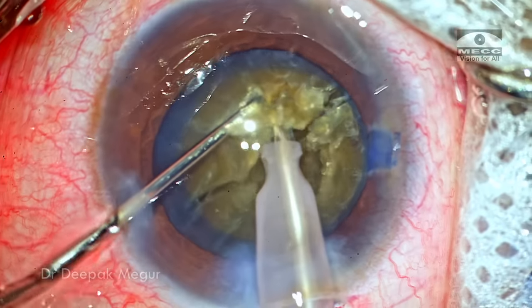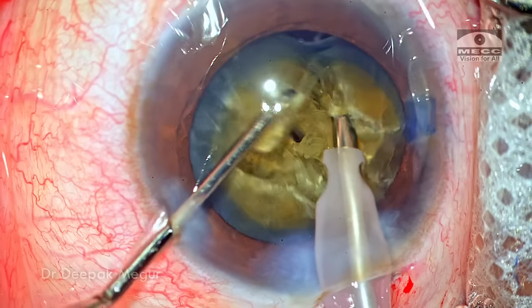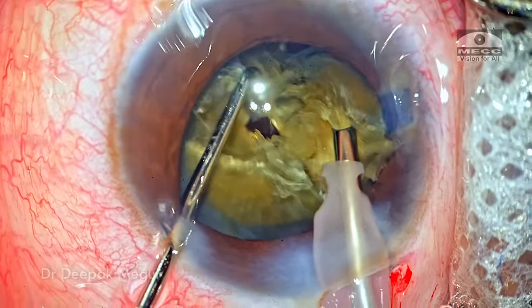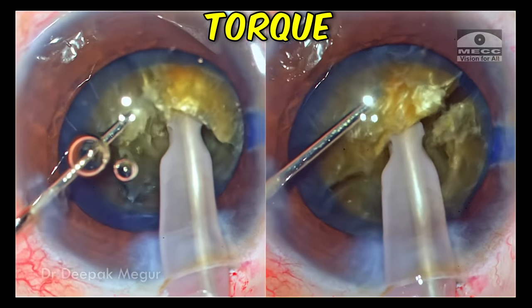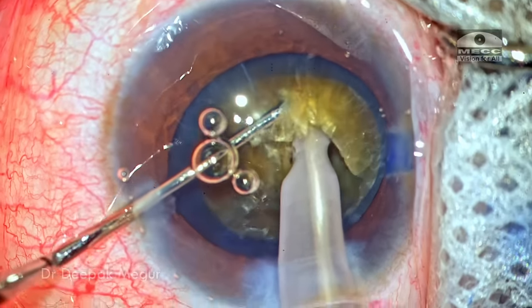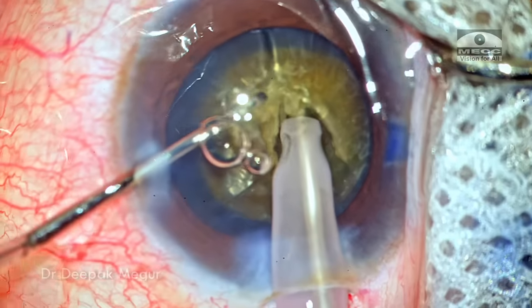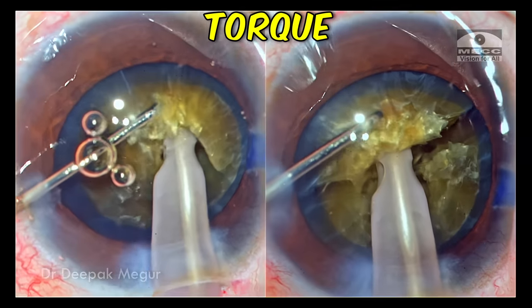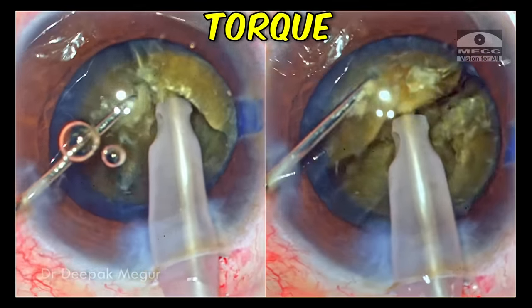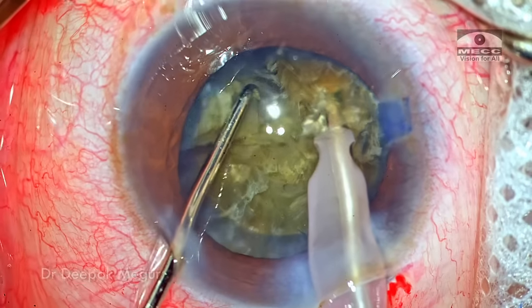To summarize: in dense cataracts it's always a challenge to divide the nucleus. It would not be wise to expect the crack to happen on the first attempt — it requires multiple attempts of lateral separation to eventually get a full-thickness crack. The first two chopping attempts were not successful because of torque induced during the vertical chop maneuver, which happens when the hold on the nucleus is not good enough. Coming out and re-engaging the nucleus in a different part — and doing so in a slightly more superficial manner — minimized the extent of torque. This was noticed in two instances in this case.